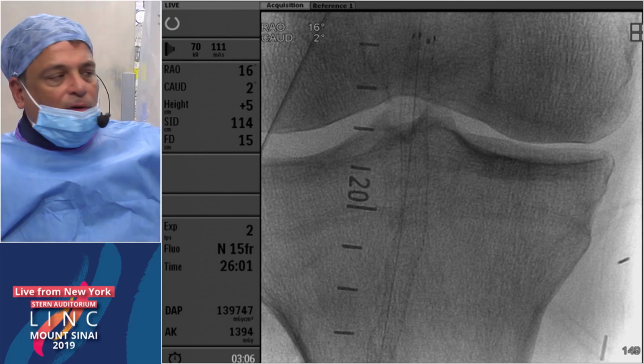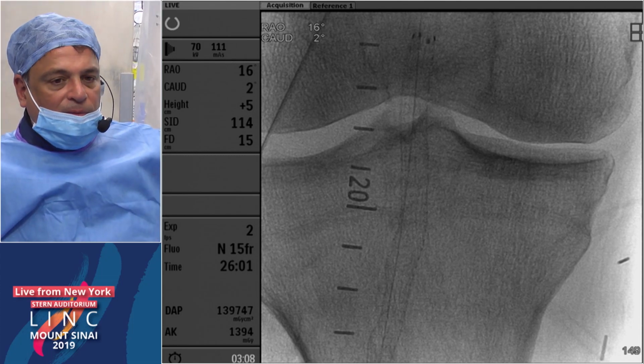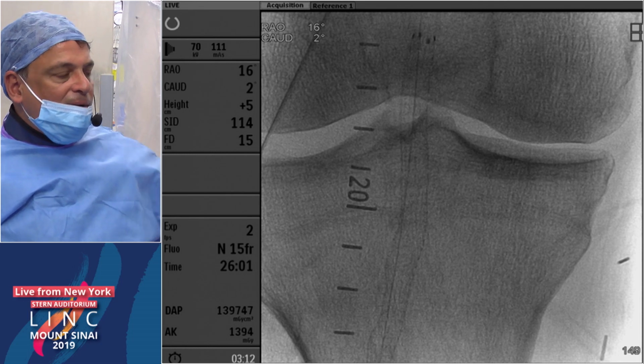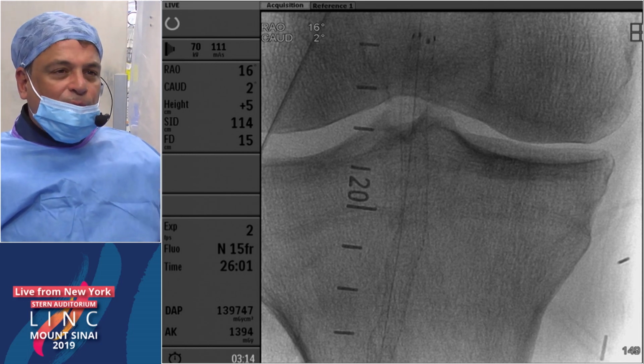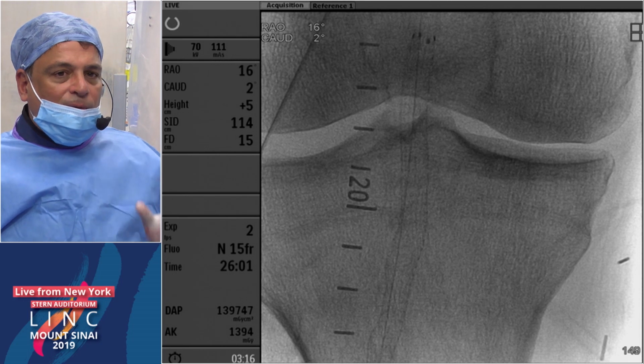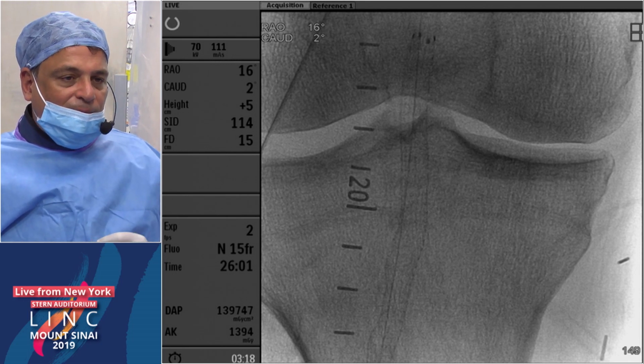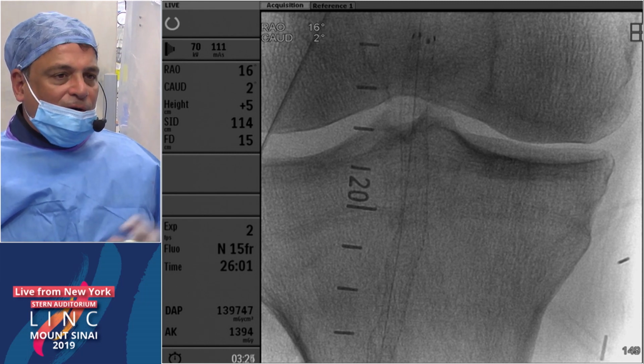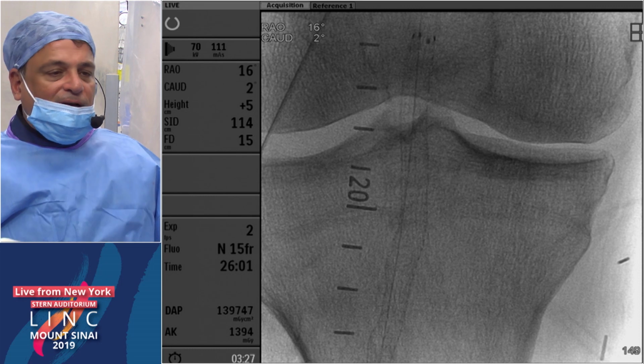Well, Brian, I know you and I probably do the most atherectomy on the panel. I don't know if Fadi or Aaron does a lot. But in this situation, in the popliteal, I'm always wary with the new M device, because it is such an aggressive cutter. Do you normally do 2 passes, or do you take 1 pass, take a picture, and then do the second pass?